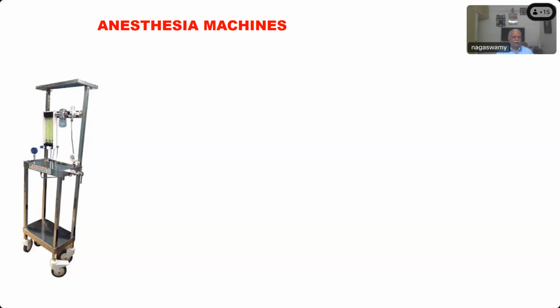Okay. And does it deliver an accurate concentration? No, sir. So this is a very basic model of vaporizer, which was used in those days before the modern vaporizers came. And you find this whole frame. What is it made up of? From the look of it, what metal or material is it made of? Stainless steel. Okay.